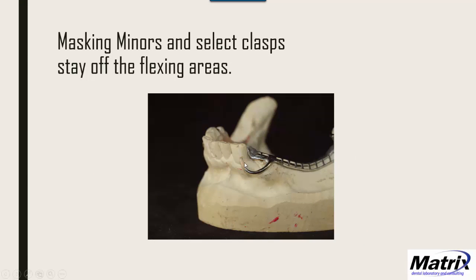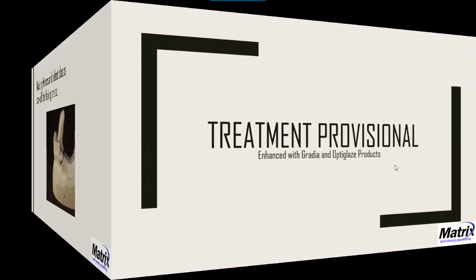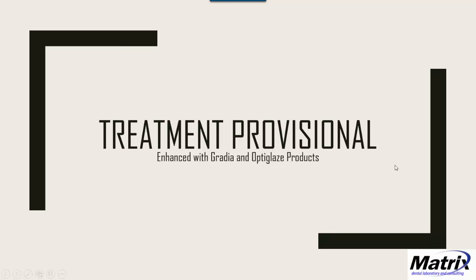And there it is — opaqued. Again, just another option, something to offer. I also use this technique for treatment provisionals, which work out really well.